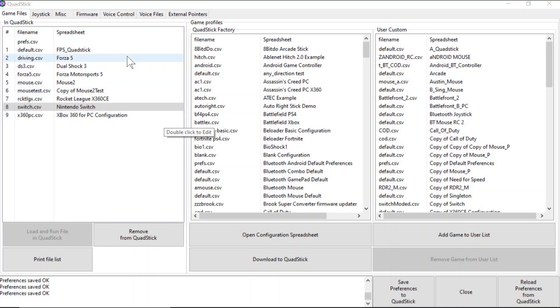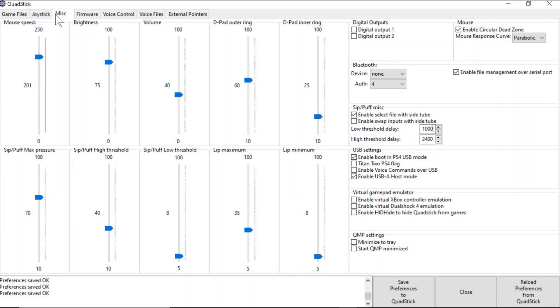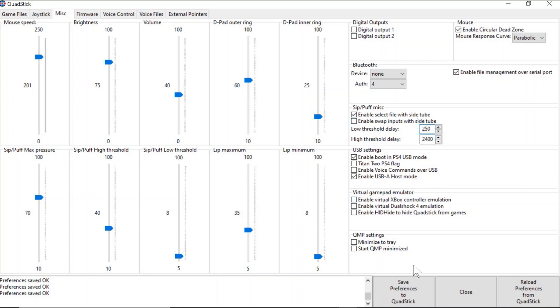This can be reprogrammed in the Quadstick Manager program. To change the delay for the Soft Sips and Soft Puffs, go under the Miscellaneous tab in the Quadstick Manager program. Then find where it says Low Threshold Delay — you can see it's currently set for 1000 milliseconds or one second. Change this to a lower number based on the user's needs. We're going to show it with 250 milliseconds or one-fourth of a second. Once changed, click Save Preferences to Quadstick to update the changes.